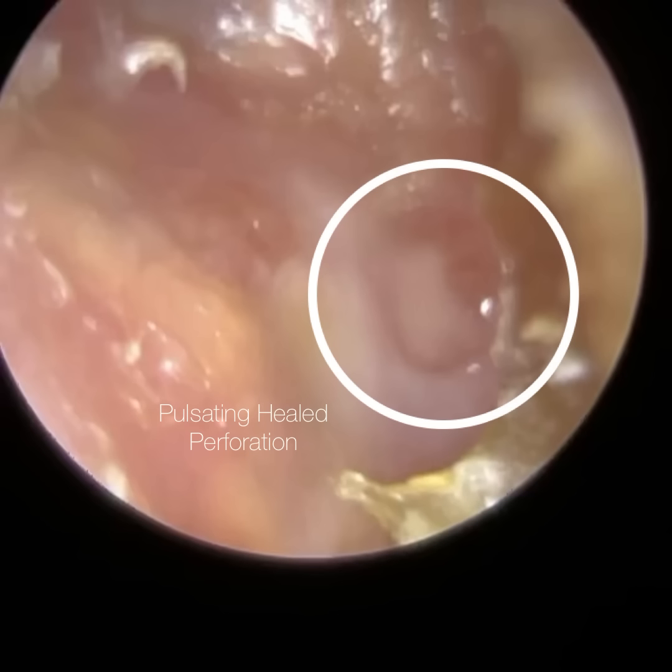So I have a feeling, when you have a perforation that's healed, quite often the outer membrane, the epithelial skin, and the innermost membrane, the mucosa, heal, but the middle membrane doesn't. So it creates an illusion that there's a hole there, because the healed membrane is always a thinner part. Instead of 3 membranes regrowing, it's only 2. And I feel that this membrane has healed, either the outer or the innermost one, and it's caused a thinning of the eardrum, and you've got fluid there pulsating.